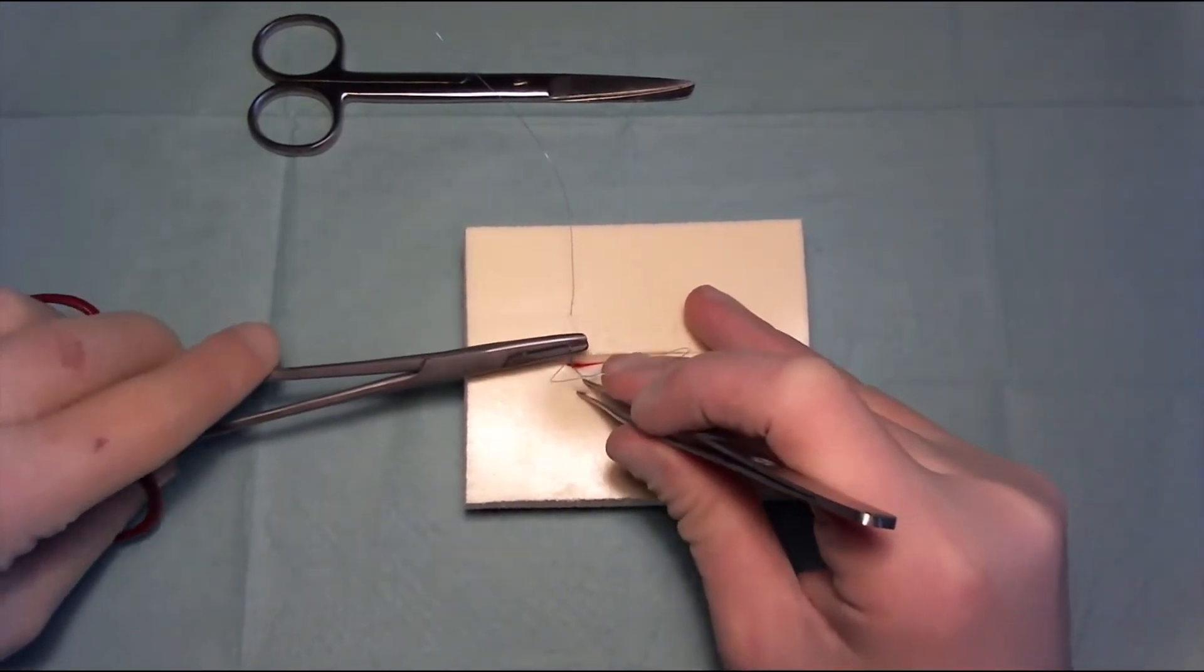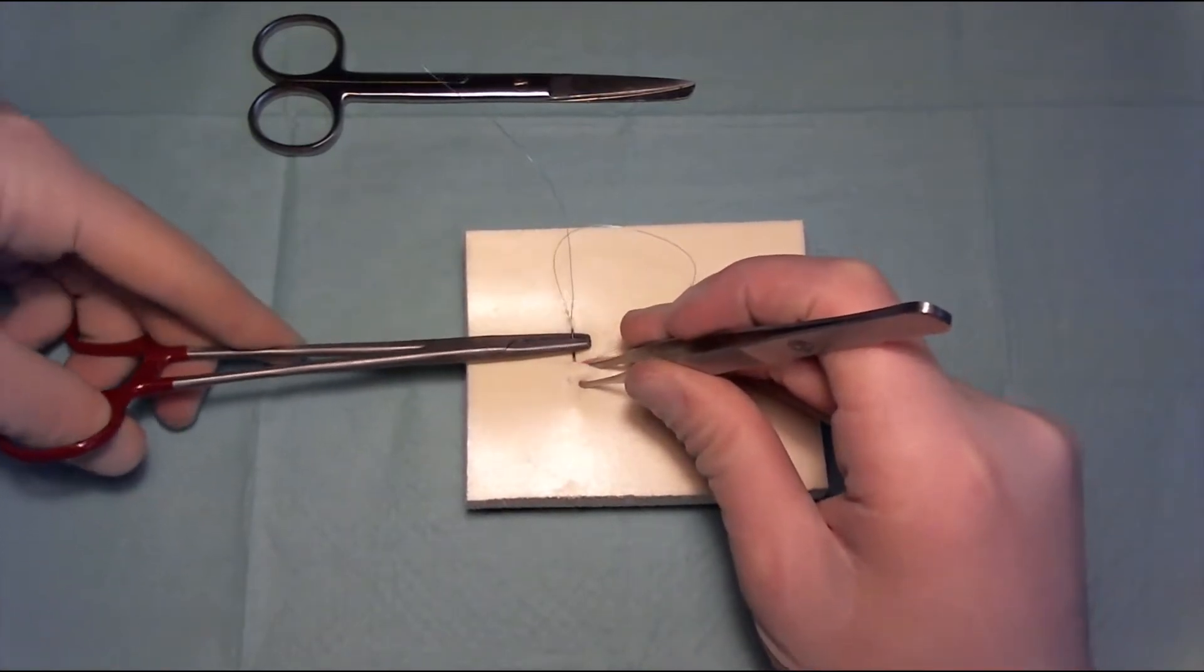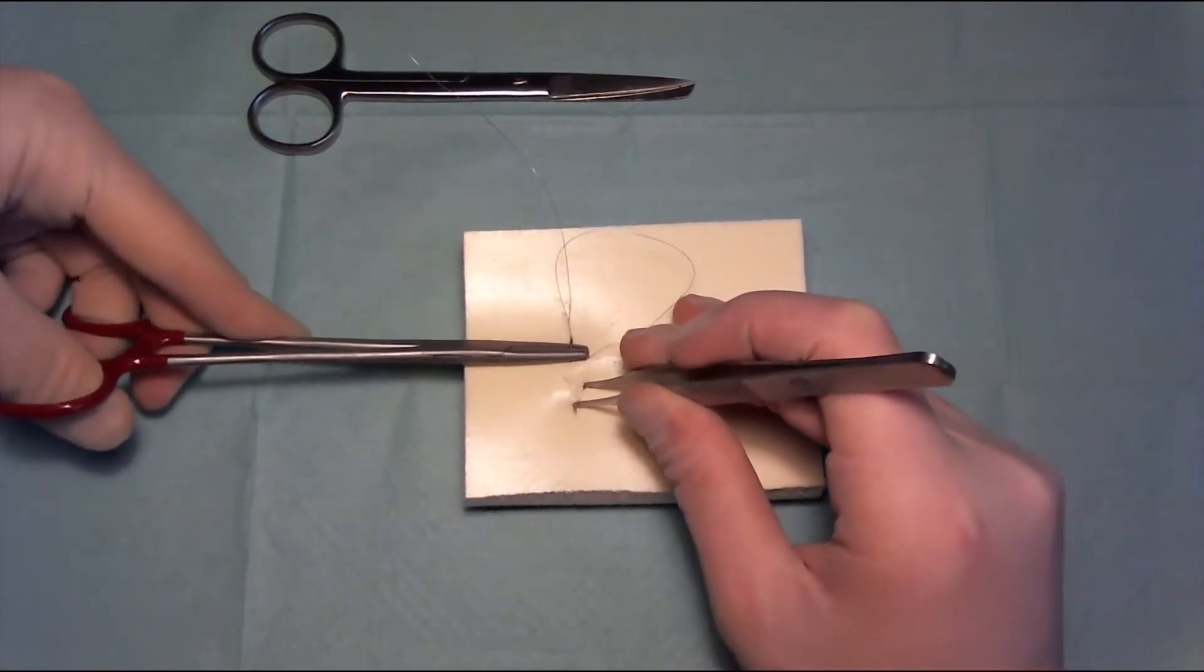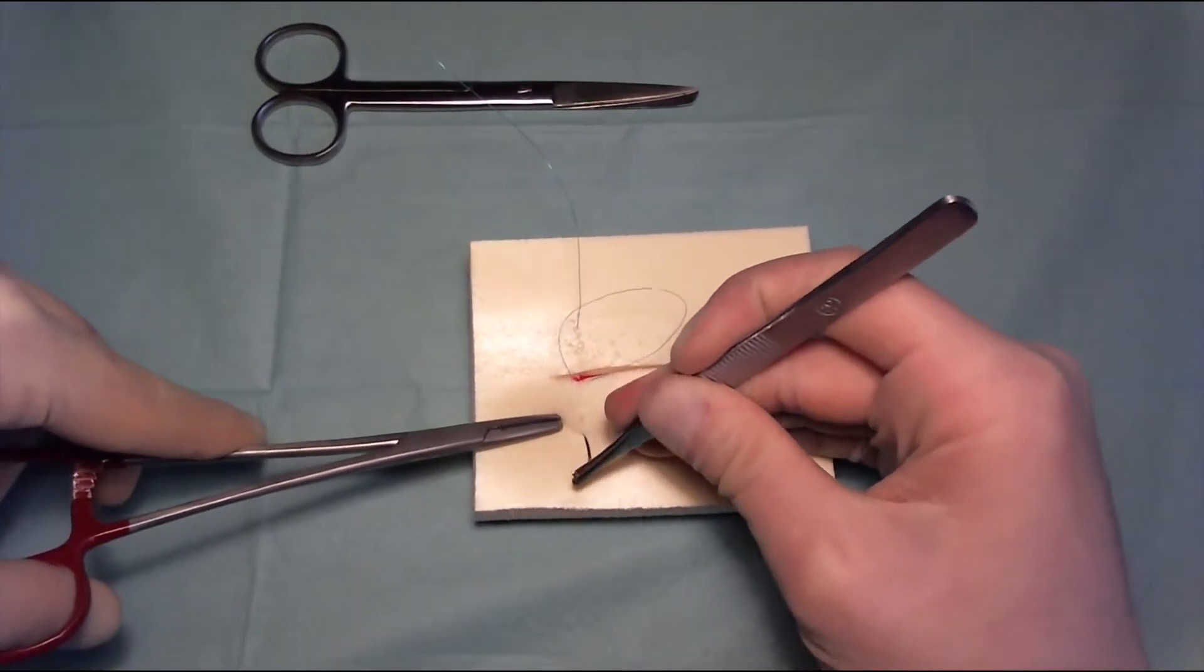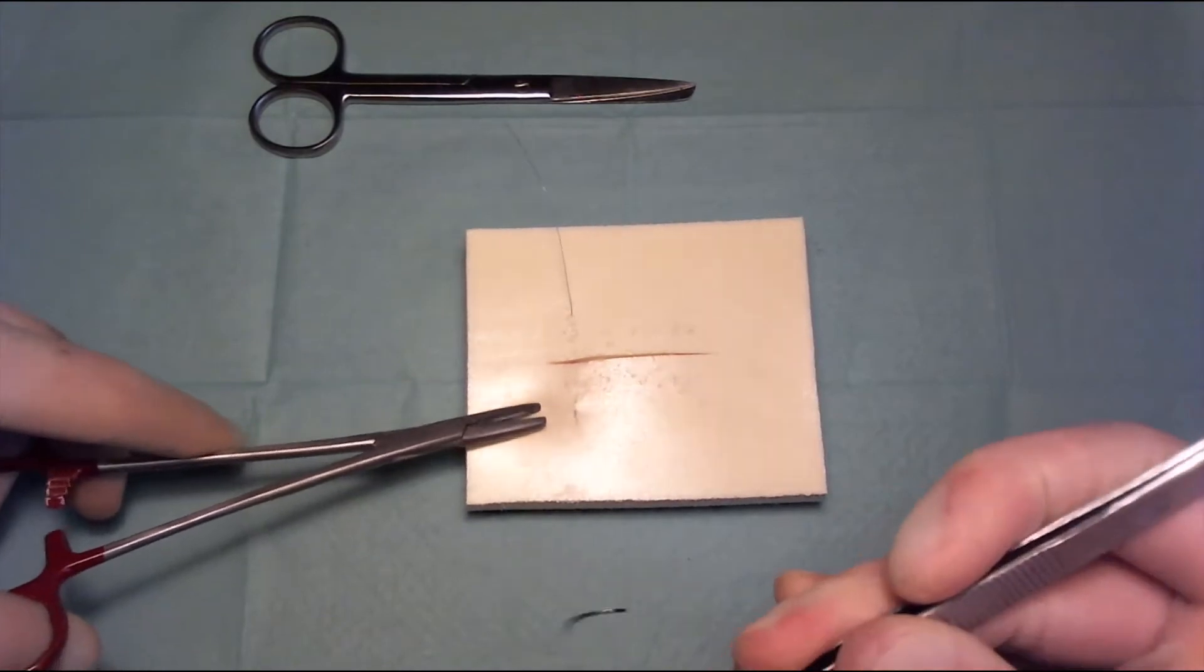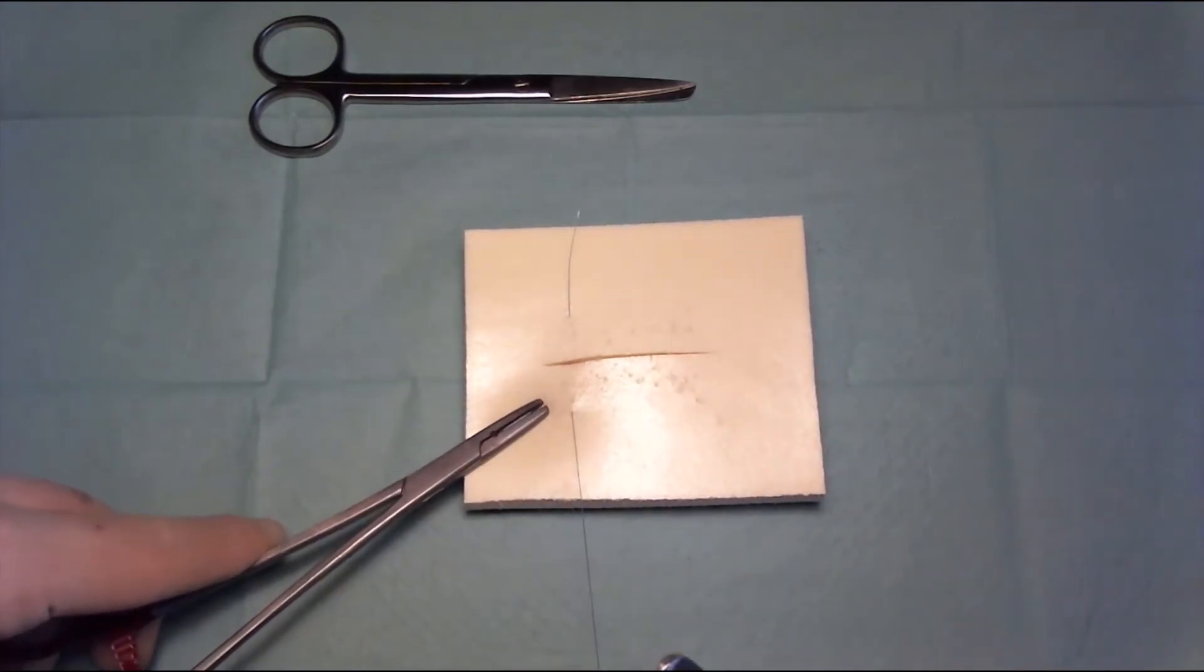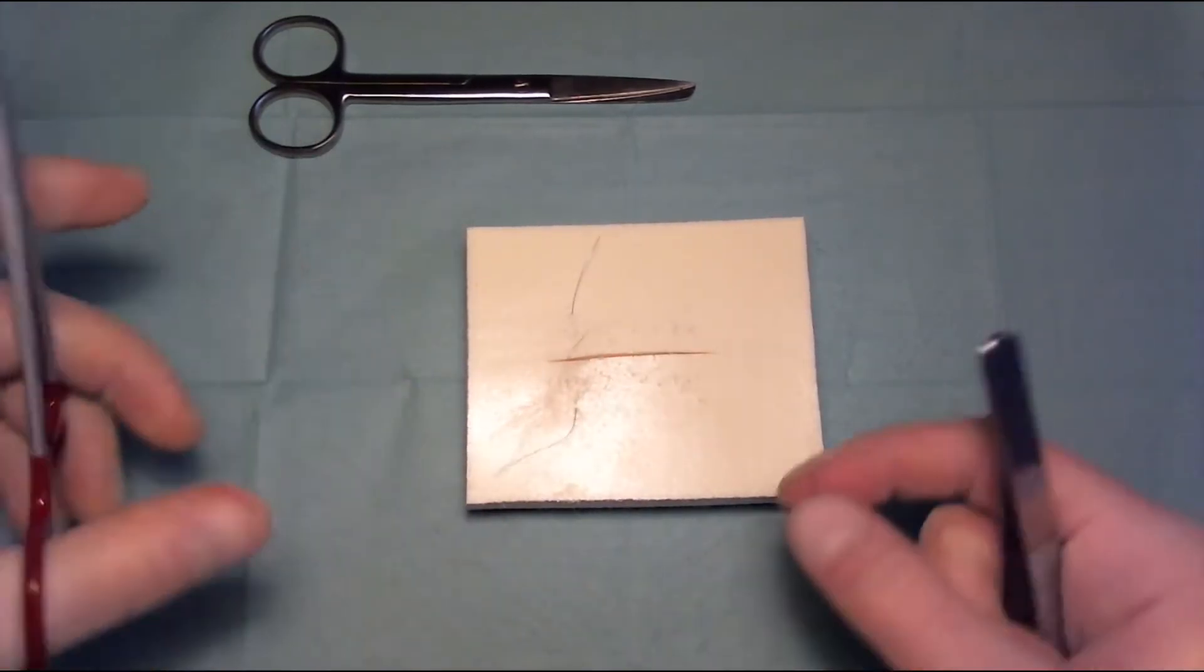So actually we're just doing a simple interrupted suture right now, but we're going to do an extra step at the end. That's going to make our Donati or vertical mattress suture special and a little bit different.